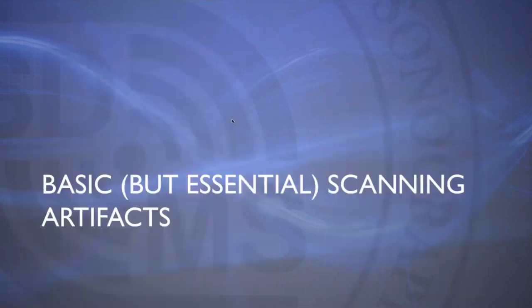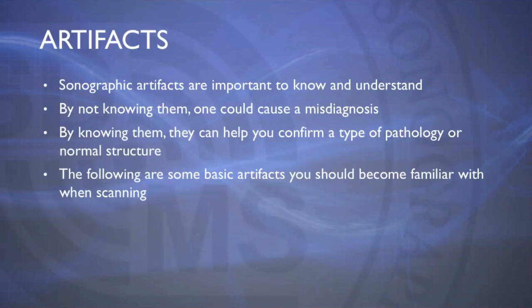Moving on to basic but essential scanning artifacts that we'll need to know when scanning the foot and most MSK structures. Artifacts are important to know and understand. By not knowing them, we could cause a misdiagnosis, and by knowing them, we can help confirm a type of pathology or a normal structure. So these are just some basic artifacts you should become familiar with when scanning MSK structures, and especially in the foot.